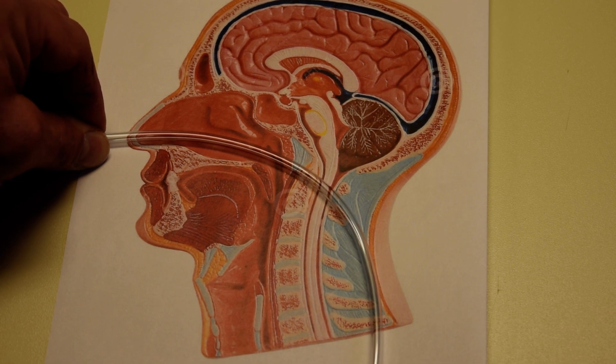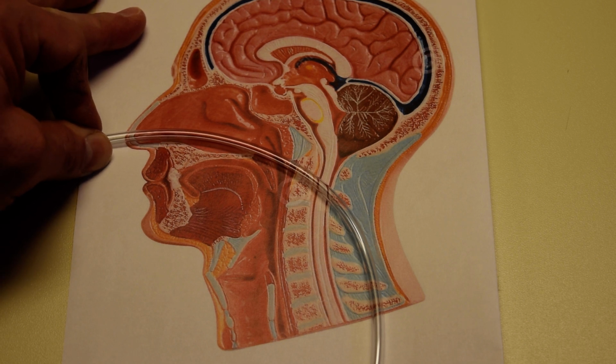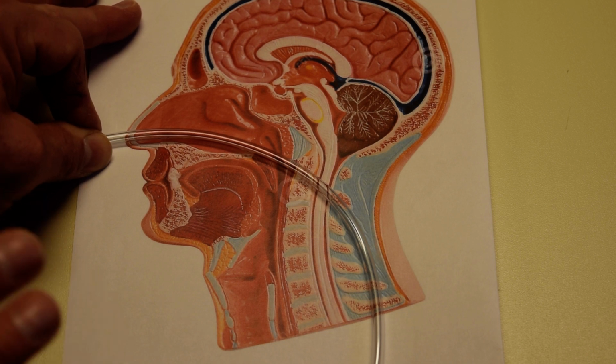And then that should be a helpful way to get your NG tubes inserted. I cannot promise you that it is going to be 100% effective every time, as some people just really struggle with NG tube insertions. It is a very uncomfortable and difficult procedure for a lot of patients to tolerate. Try to be patient, try to be calm, try to be reassuring, and again, don't hesitate to stop if you feel that the patient's not tolerating things.